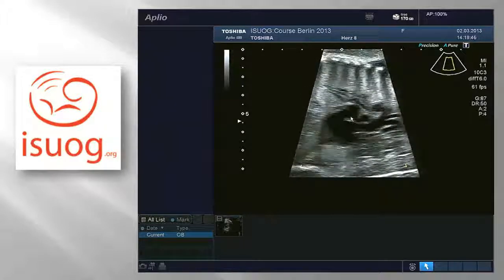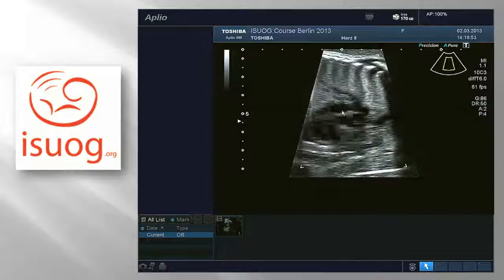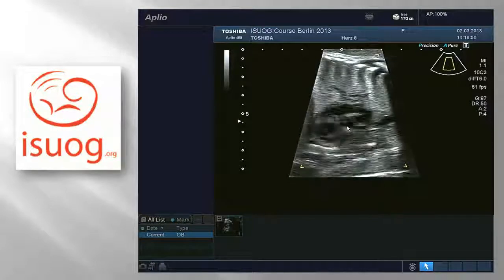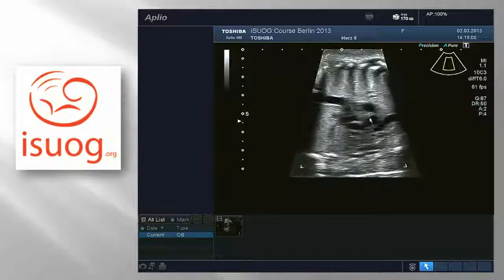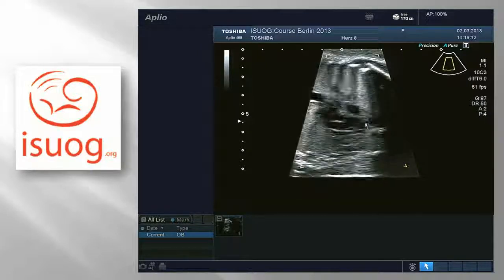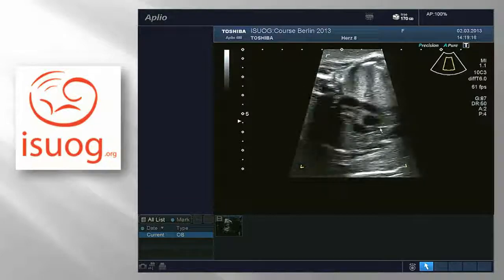So in here we see the left atrium behind, the right atrium in the front, and the aorta in the middle, wedged between the two ventricles. That's the aortic valve. And then coming up the ascending aorta, the first head and neck vessels, the transverse aortic arch, and going down to the descending aorta. This is the innominate vein coming here, the one that Rabbi is going to talk about, the brachiocephalic vein seen on the sagittal plane. This is coming from the head. So there are lots of things you can see from all sorts of planes.